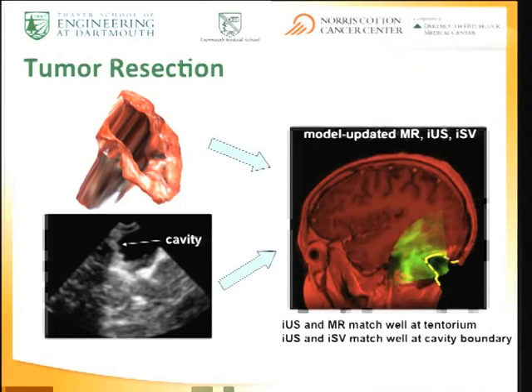And we're doing things with, of course, resection. And this is another example of using this information, projecting it, capturing it during the surgery, using it in the model estimation, and then projecting the model estimation back onto the MR to produce these updates. And you can see this is the guiding information, so in the update, it does return back, although we don't enforce it exactly. It's a model matching or estimation process, and so it all looks pretty consistent.